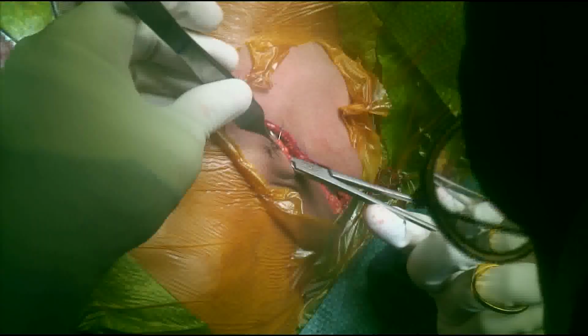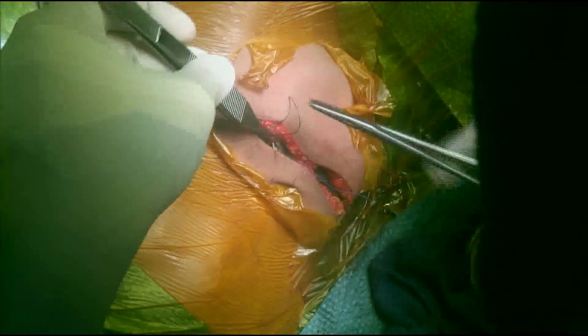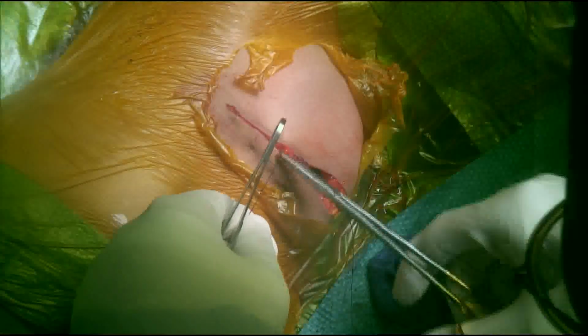If so, this could indicate that the patient is developing a seroma, or even worse, a cerebrospinal fluid leak. In such a case, the initial management involves pressure dressing and observation for potential improvement.